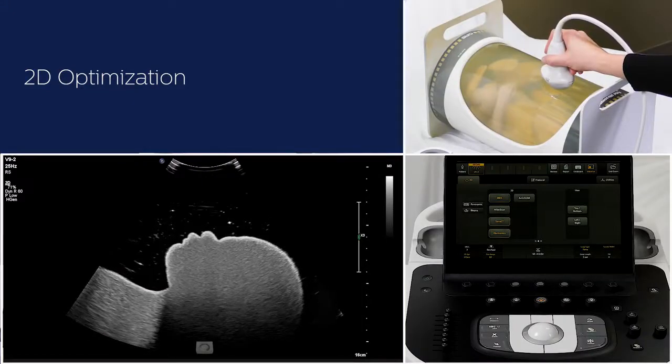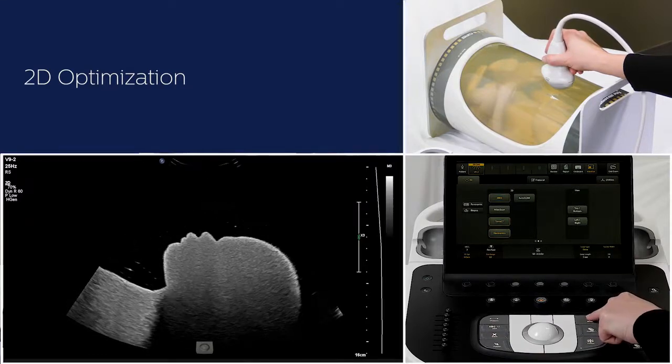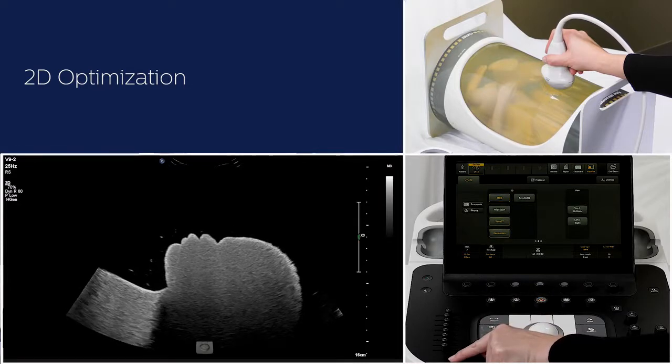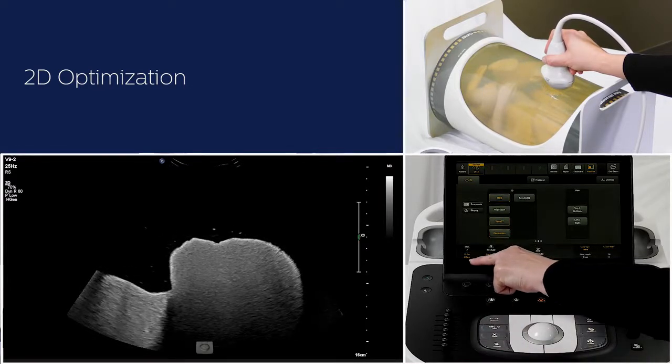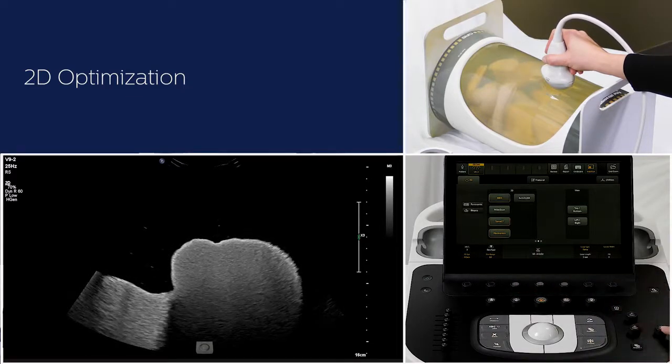Volume acquisition begins with optimal 2D imaging. This step is of utmost importance when acquiring a dataset. The goal is to have a final volume dataset with good resolution and optimal contrast. We can do this by pressing iScan that optimizes 2D gain and TGC, and/or adjust settings such as X-res, 2D opt, dynamic range, depth, and focus.